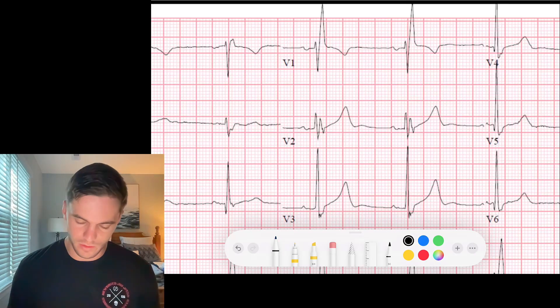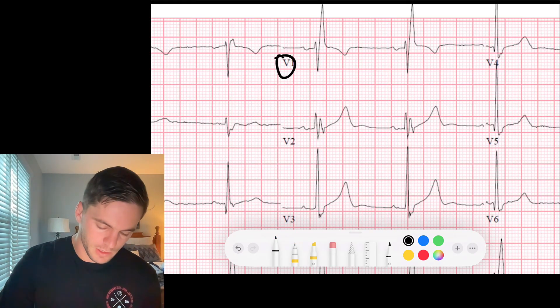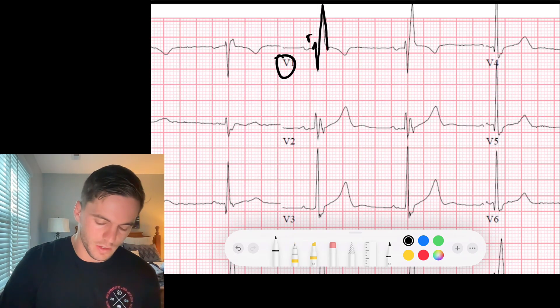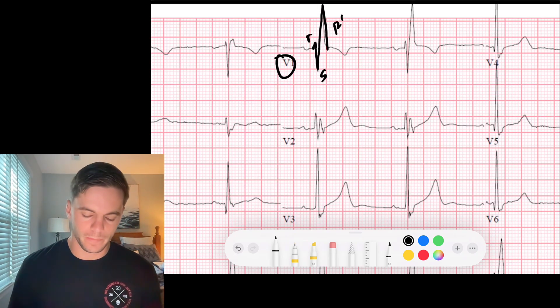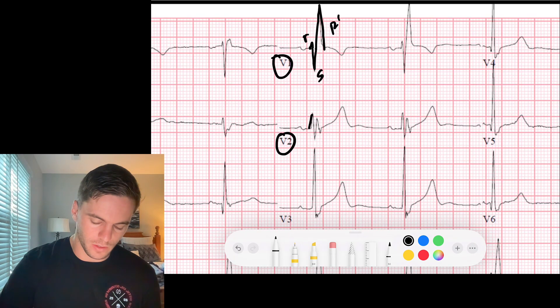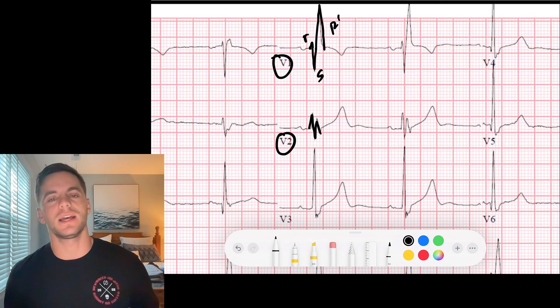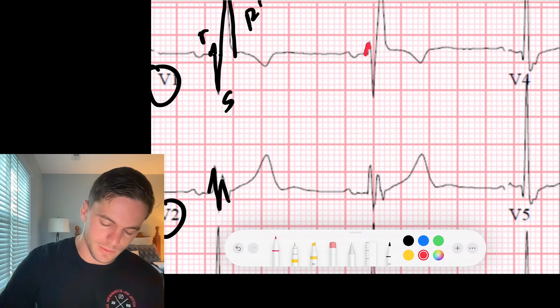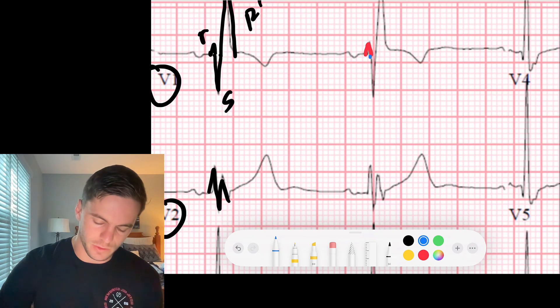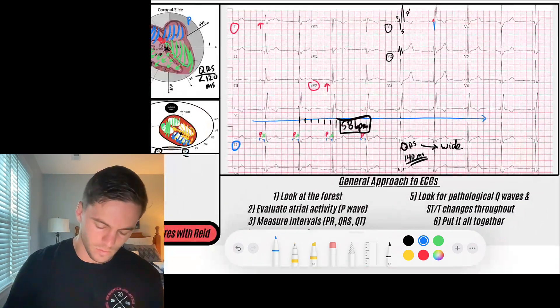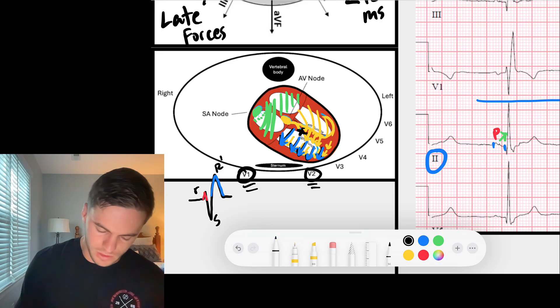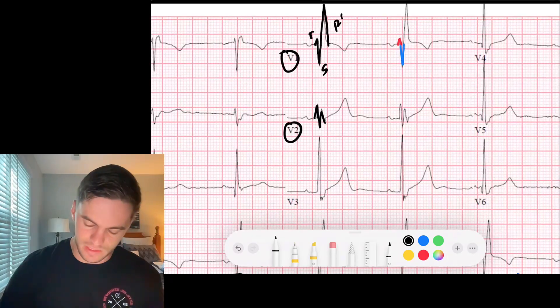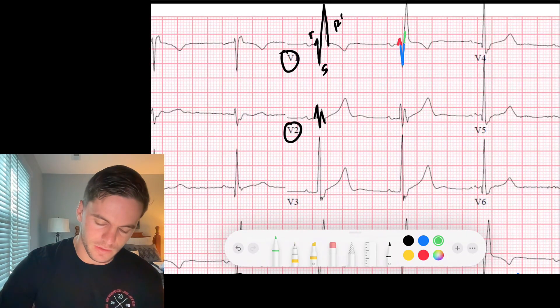So we get an R, S, R prime in V1. And that is our septal R wave, our S wave, which is the rest of the left ventricular depolarization, and then our R prime wave, which is late forces going towards the right. That is very characteristic of a right bundle branch block. And so if you take a look here at V1, look what we get. We've got a little septal R wave. We've got our S wave. And then we have this nice R prime wave. There's an R, S, R prime.